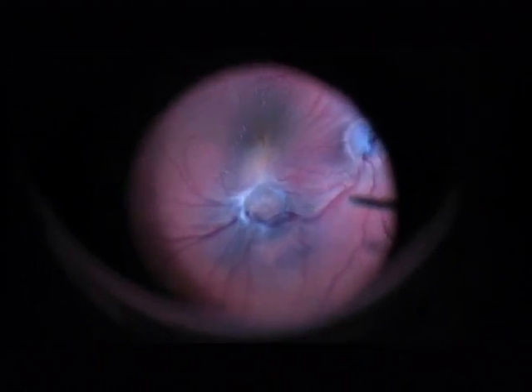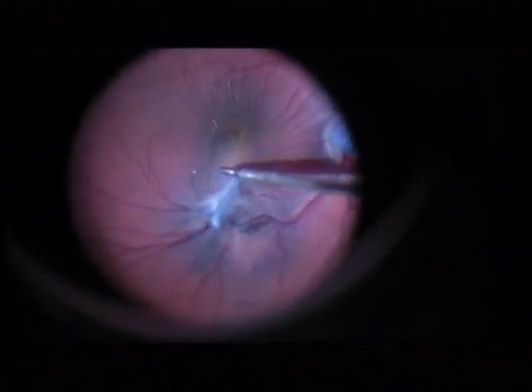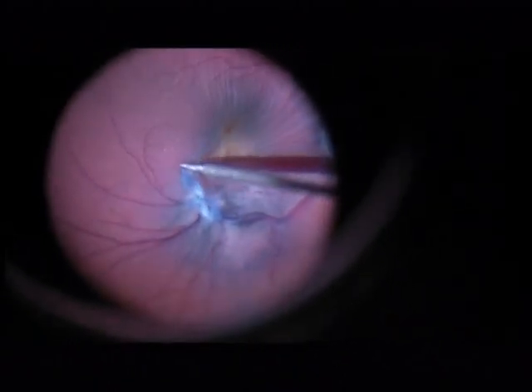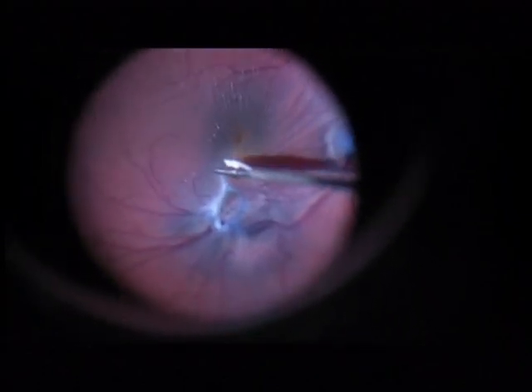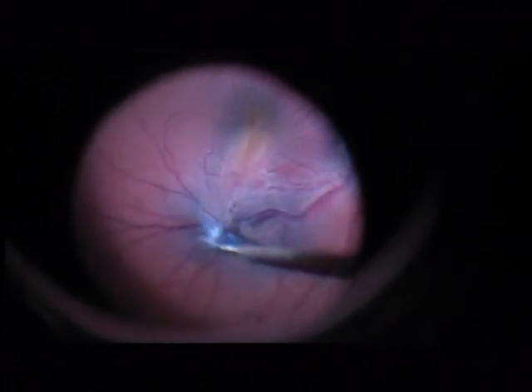The Atkinson cannula is a semi-sharp cannula. Now I found a grip to remove the membrane. This is an ultra-peel forceps from DORC, 27-gauge. It is my favorite forceps for peeling membranes and ILM.